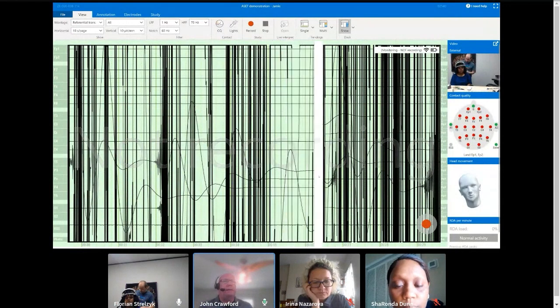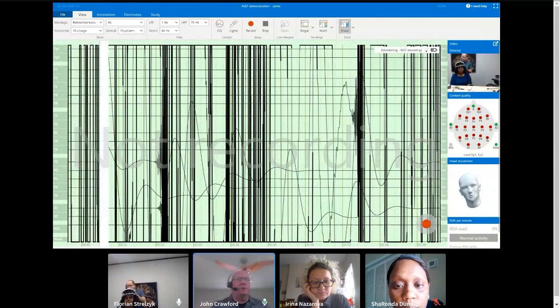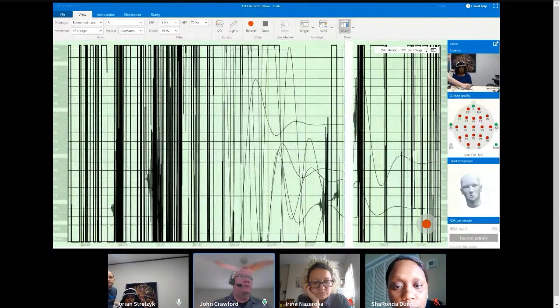But once again, ideally, we want the best signal. But sometimes, overnight in ICU, if we're trying to rule out status, no status, sometimes we can answer that with a lot fewer electrodes if a couple of them are messy.